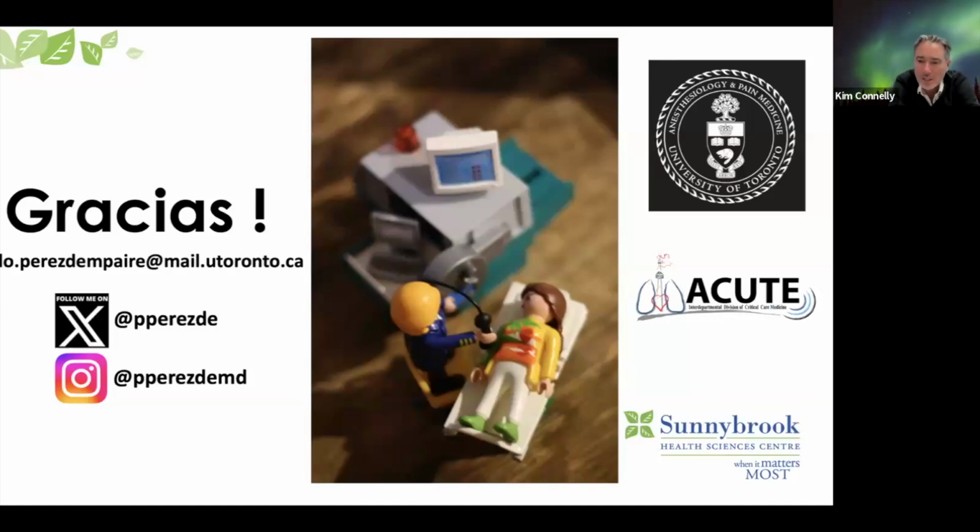One issue, when I tried to do this years ago in Australia, this was a long time back, we actually had some issues with the TE probes being damaged during CPR. I'm wondering, have you had any issues with that? I can't remember if the damage was because people just pulled it out and it got whacked on something, or if it was actually due to chest compressions. The crystals were actually damaged, so the probes were then not used afterwards. Have you seen anything like that, or is this basically just me showing my age, and it was 20 years ago when we did this?